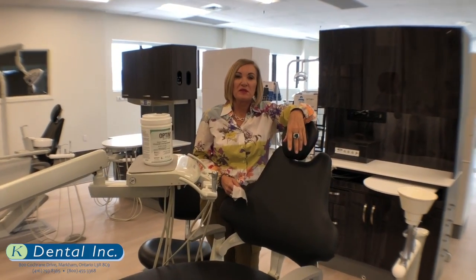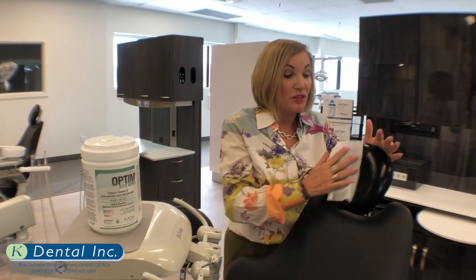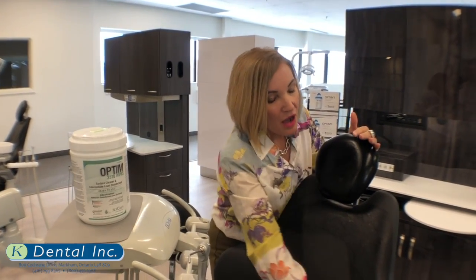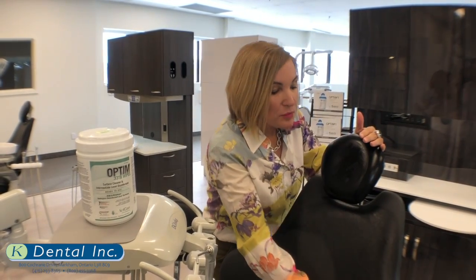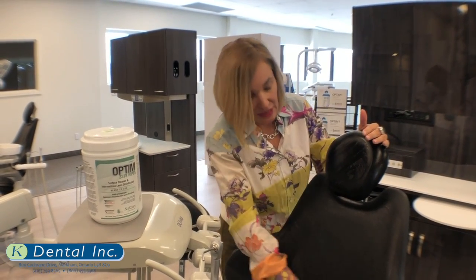It's important for your hard surface disinfectants to know the contact time. What is a contact time? A contact time is the length of time that a surface has to remain wet in order for the disinfectant to do its job. Optim 33 TB is a broad spectrum disinfectant cleaner all in one. For disinfection of your surfaces, you'll be covering yourself against tuberculocidal, bactericidal, and virocidal in one minute. And for your fungicidal, it's a three minute contact time with your Optim 33 TB.